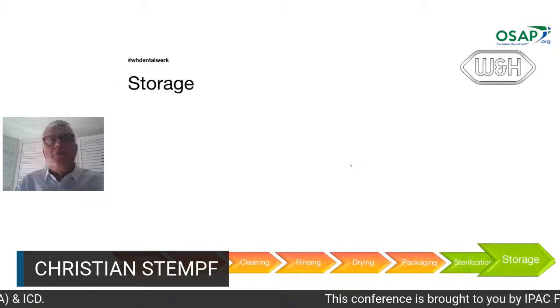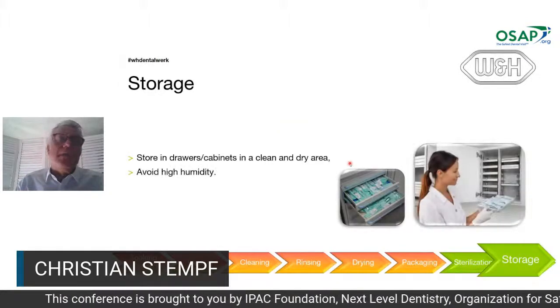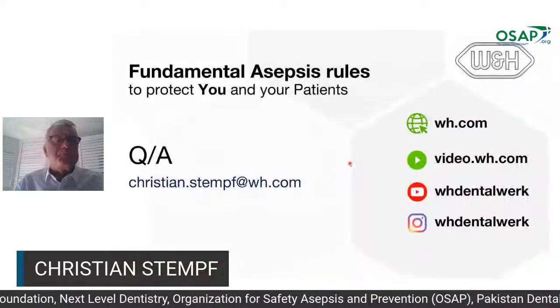Storage: store in a dry area, avoid high humidity, and you can store for, depending on the country, from 1 to 3 months.